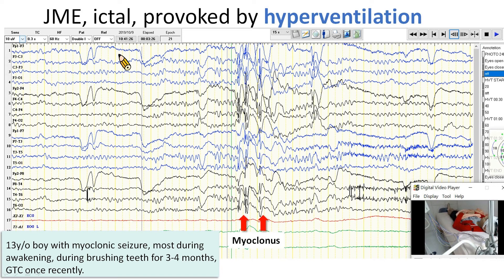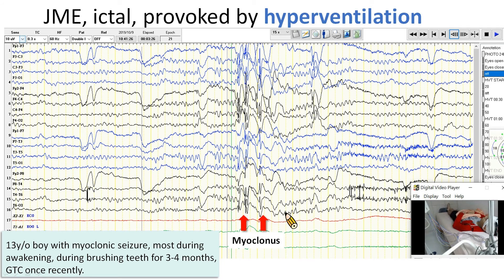This is a 13-year-old boy with myoclonic seizures mostly during awakening — during brushing his teeth — for three to four months. He had one generalized tonic-clonic seizure recently. During hyperventilation, myoclonus occurred, which was associated with generalized polyspike-wave discharges.